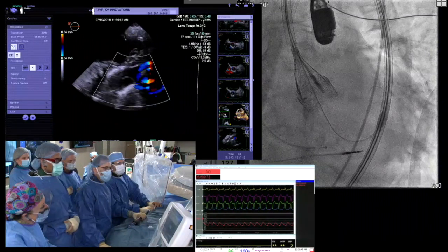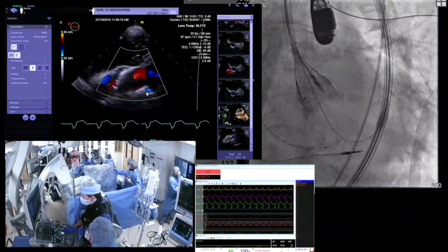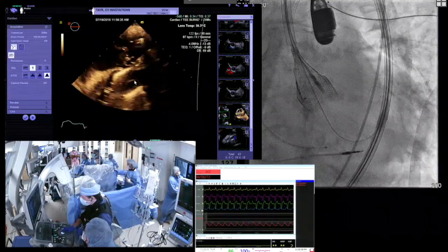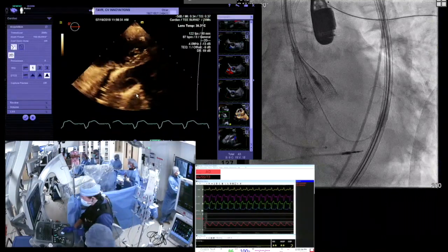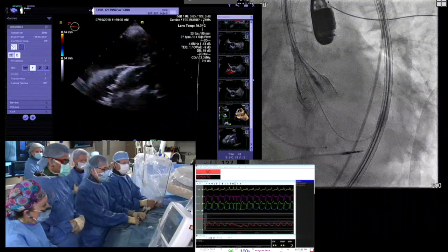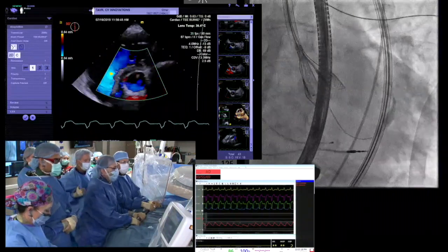Okay, Bob, what are you thinking? So we're still seeing that tiny bit right there, that little spray, and using the cursor, I can show you right there. That's our tiny bit of PVL. There's a little bit of central as well, right there by the leaflets, as we take color off, and that's all wire related. So Becky, you would rate this trivial, I'm guessing? Yeah, this would be trace. I mean, I might try to go to one other view, but this is pretty good. Where else would you like to go, like a 120, just 150? Yeah, we can do that, or you can do a short axis on this one.